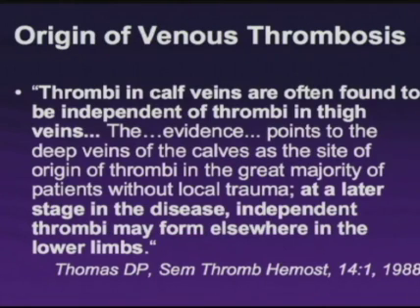When we look at the natural history of venous thrombosis, we recognize that thrombi tend to begin in the small veins of the calf. As this process develops, the thrombus doesn't necessarily grow continuously from the calf into the more proximal veins, but the thrombi now are seated in other veins which are present. So independent thrombi are present. That means when you scan patients, you may find thrombi in one vein, see a normal segment, and then see thrombi in a second venous segment.